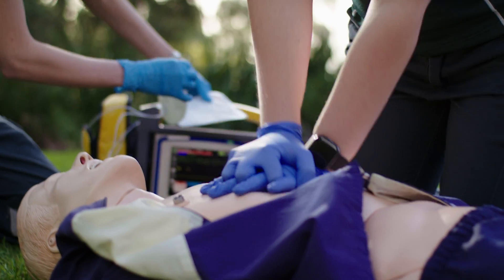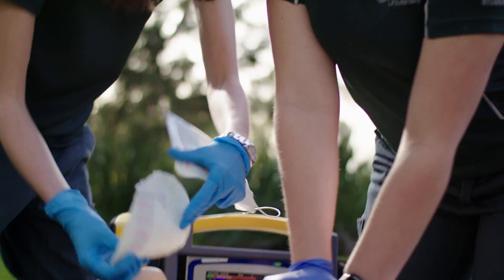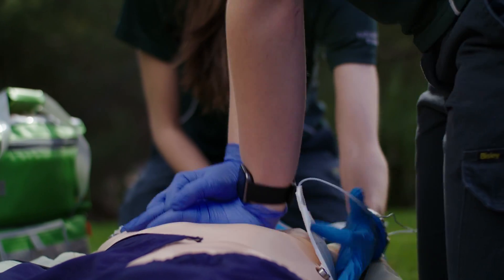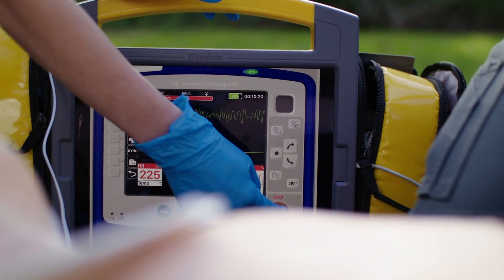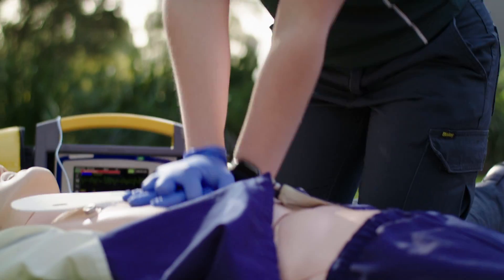A heart attack is actually an occlusion within the heart itself, whereas a cardiac arrest is caused by the cessation of blood flow due to the heart not functioning appropriately. Defibrillation attempts to stop that irregular heart rhythm and begin a normal rhythm. Once the defib has been applied, we continue with compressions.